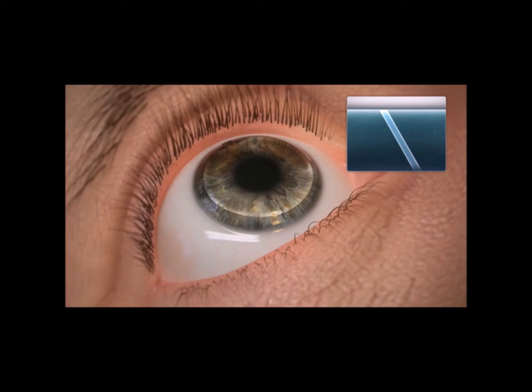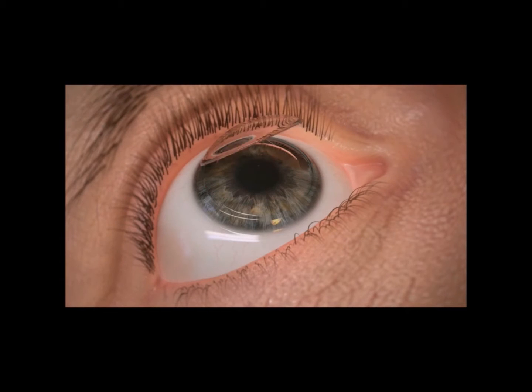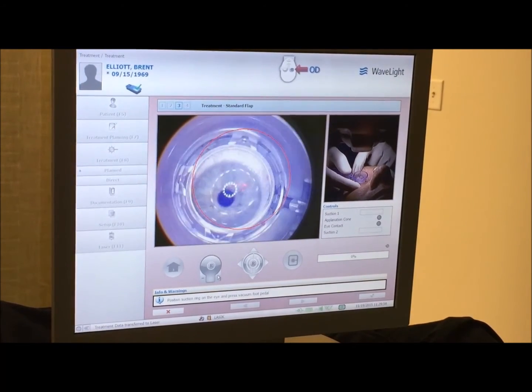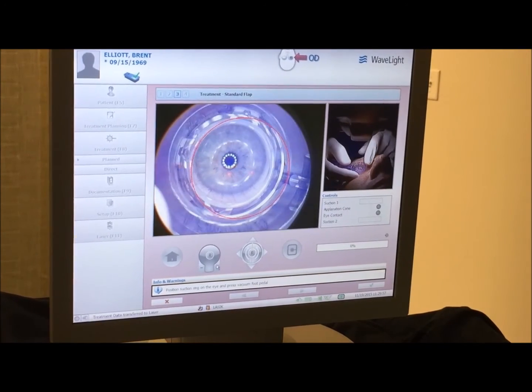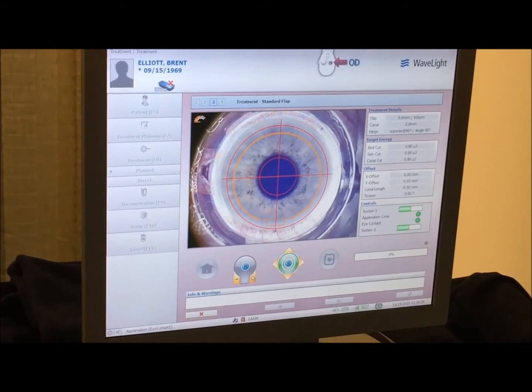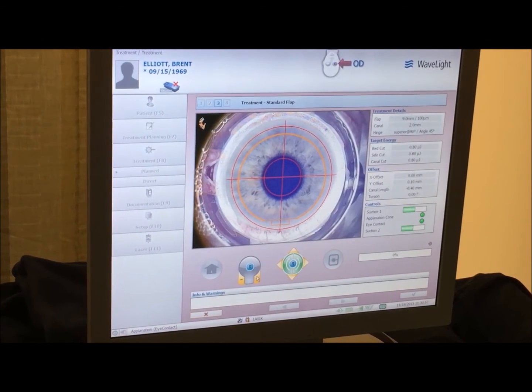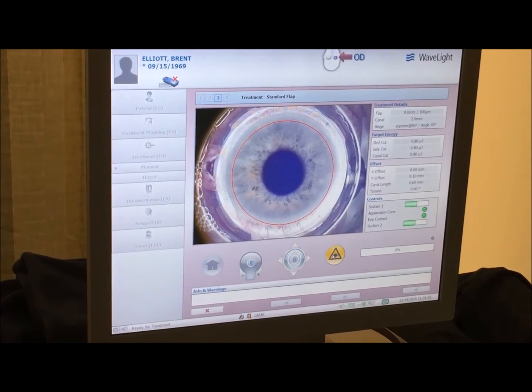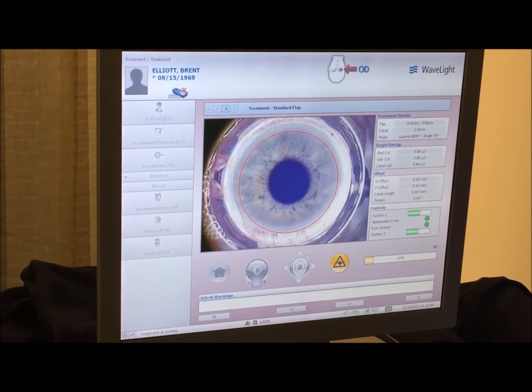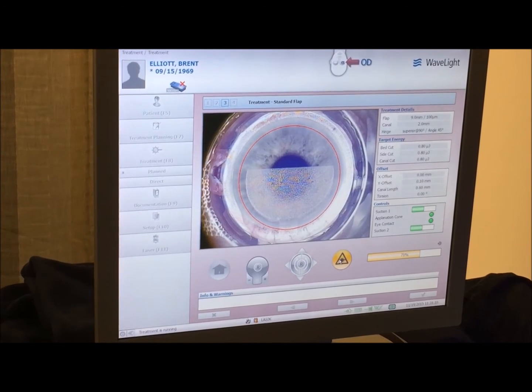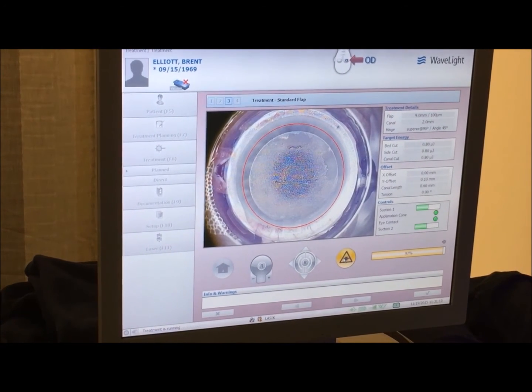Primarily the flaps are made in a similar fashion. I typically taco the flap back myself as you'll see in the videos to follow. This is an actual patient. I still do a slight superior placement of my suction ring. Automatically as the second suction is enacted, you see the two green bars on the right. You see the blue circle centering on the pupil. My technician really has to do very little, which adds to the fact that we're not on the eye with suction very long — and the flaps are sub nine seconds.